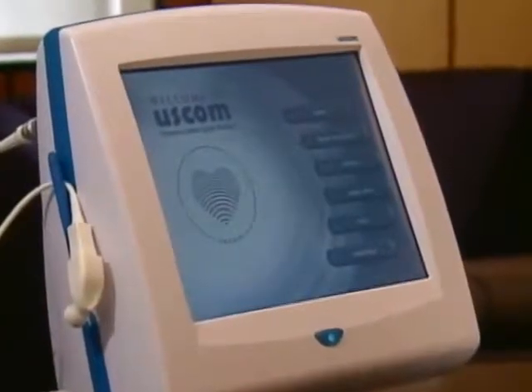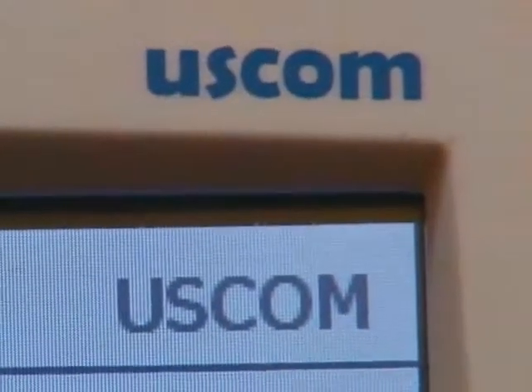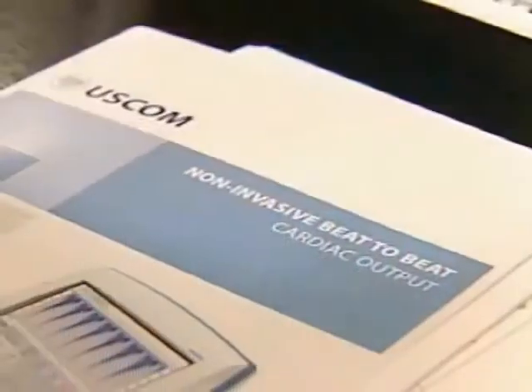First of all, Uscom stands for Ultrasonic Cardiac Output Monitor, and we are an Australian-based company. We believe that hemodynamics are very important and that objective measurement of hemodynamics leads to improved outcomes and lowers costs. Uscom is the best non-invasive hemodynamic measurement system.